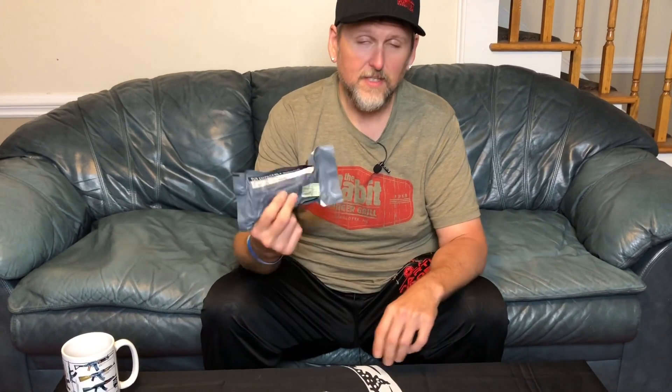Hey everybody, today I'm going to show you how to use an Israeli bandage — the Izzy compression bandage. There are different terms for it; a lot of people call it the Izzy bandage. It has these tear tabs. First of all, save the packaging, and I'll tell you why as you tear through it — there are some potential uses for it.